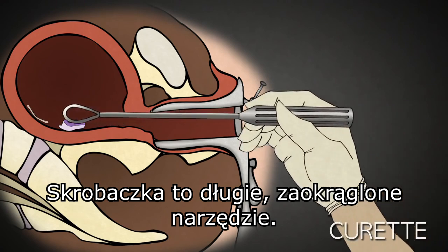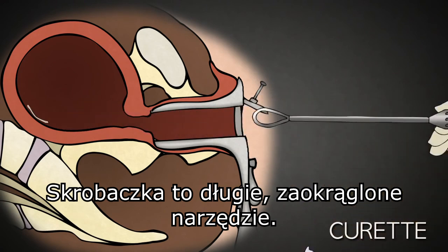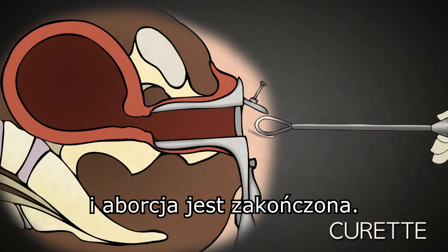The curette is basically a long-handled curved blade. Once the uterus is empty, the speculum is removed and the abortion is complete.